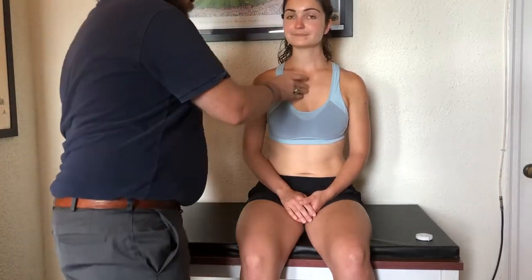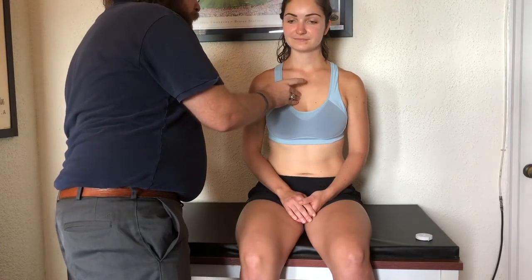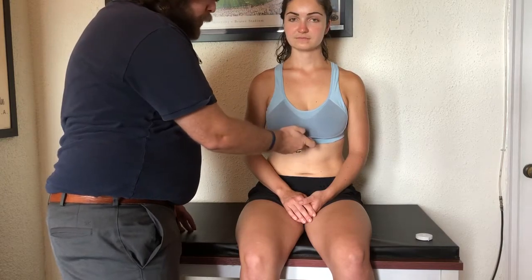So again, angle of Louis — not by poking your chest too hard. Find the second rib, third rib, fourth rib. Typically we would just listen here, or you can go from the xiphoid process and slightly lateral. We're just going to come a little bit more lateral. For this we can listen over clothing just to maintain patient modesty — so if they have a sports bra on you can place the stethoscope over it. Again, we're making a modification anyway.